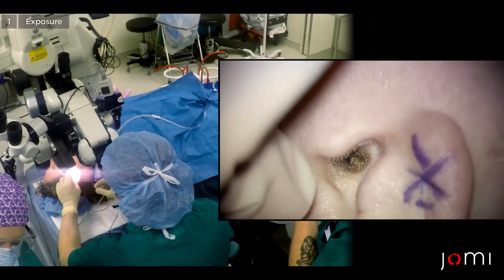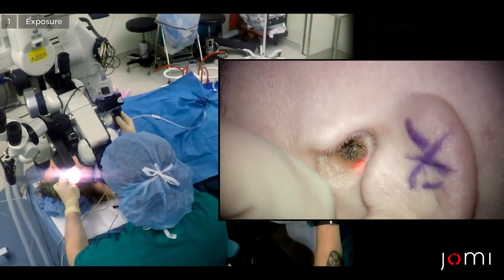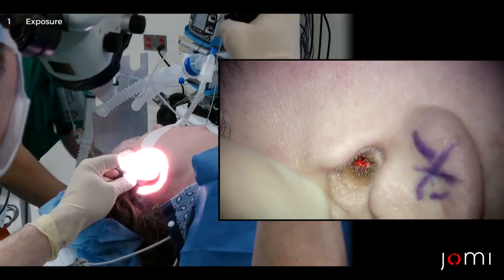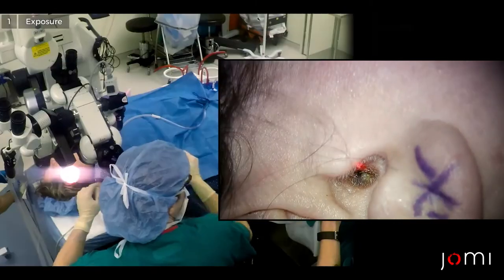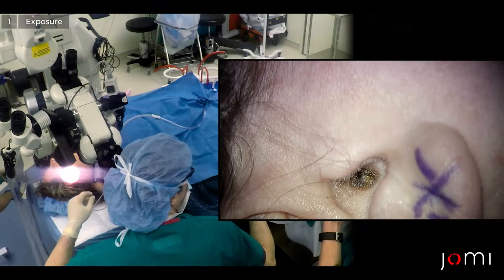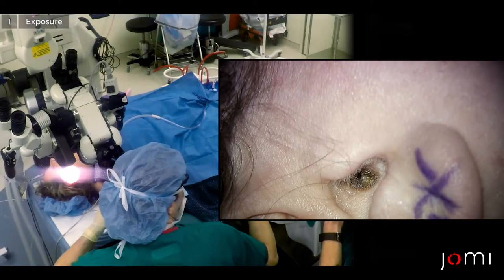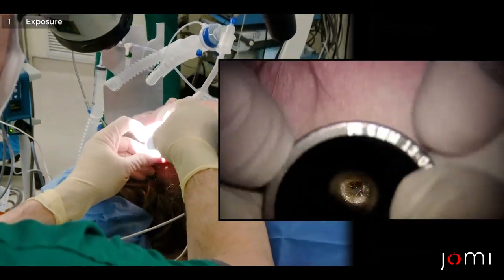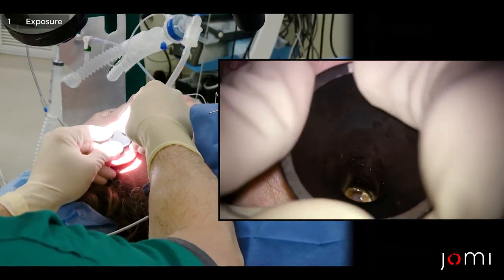This woman has eustachian tube dysfunction and has a globally retracted eardrum. She's had eight sets of tubes in the past. What we're going to do is take a six speculum and perform a laser myringoplasty, which tightens the eardrum and allows the collagen that's all stretched out in the middle layer of the pars tensa to snap back to its native configuration.